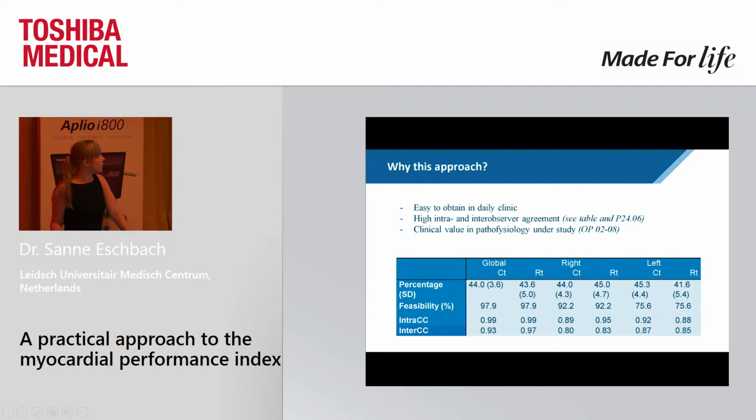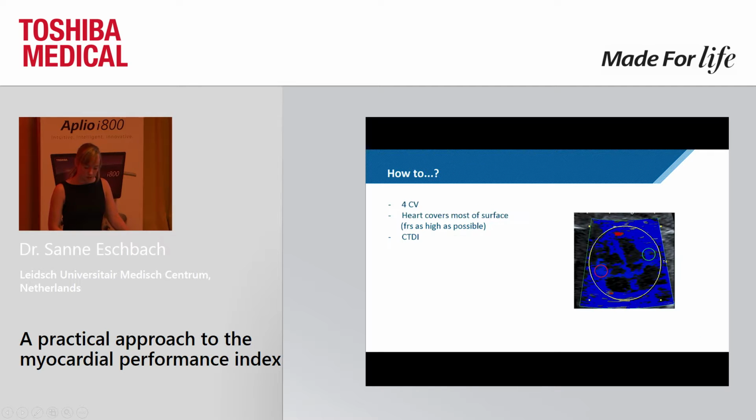Next to that, of course, the clinical value of this new approach should be studied as well, because if it doesn't find sickness or pathophysiology, it's of course worthless. So we tried, and we are already busy with that in the TTTS recipients. I also had an oral poster about that one, and we can see differences in children who have decreased myocardial performance. But of course, we are going to keep it as practical as possible. So let's just look, how can we obtain this? How can we do this?